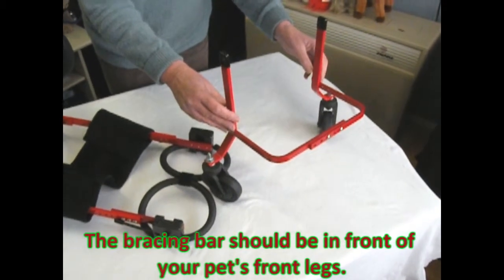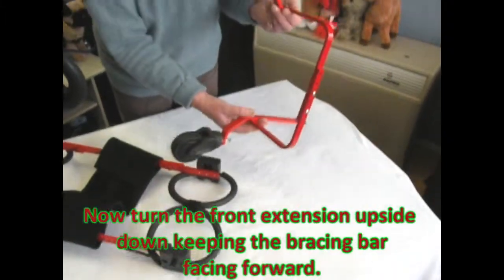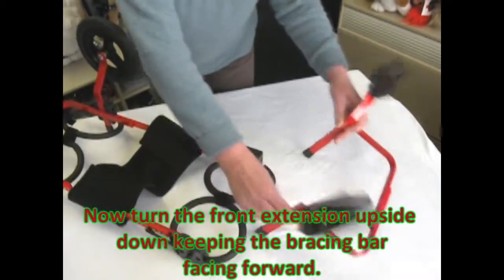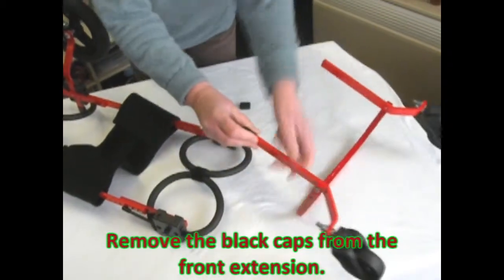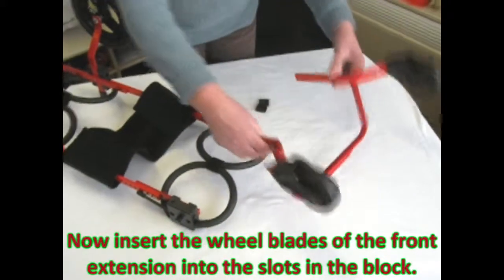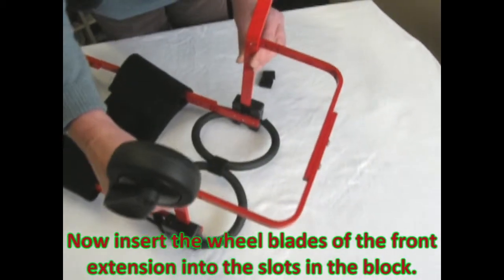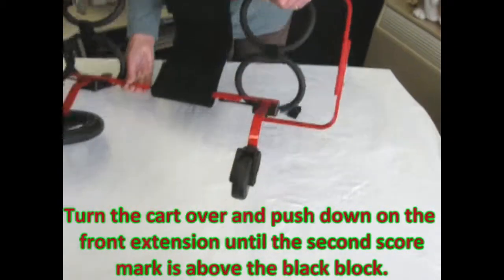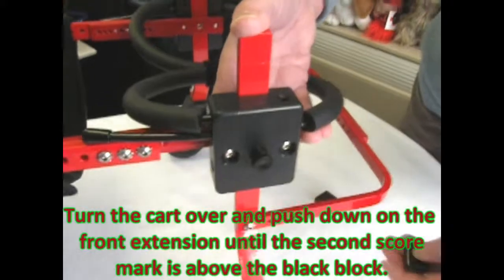The bracing bar should be in front of your pet's legs. Now turn the front extension upside down keeping the bracing bar facing forward. Remove the black caps from the front extension. Now insert the wheel blades of the front extension into the slots in the blocks. Turn the cart over and push down on the front extension until the second score mark is above the black block.